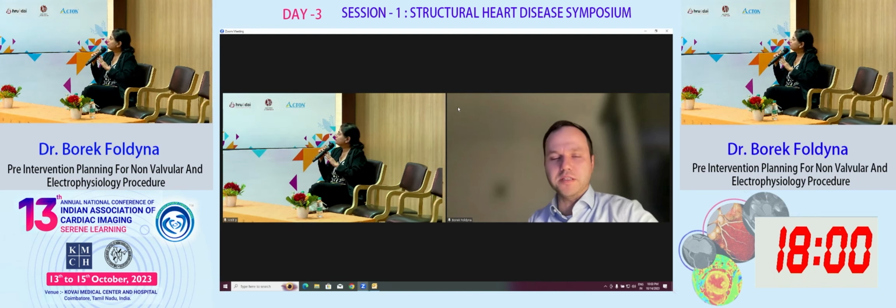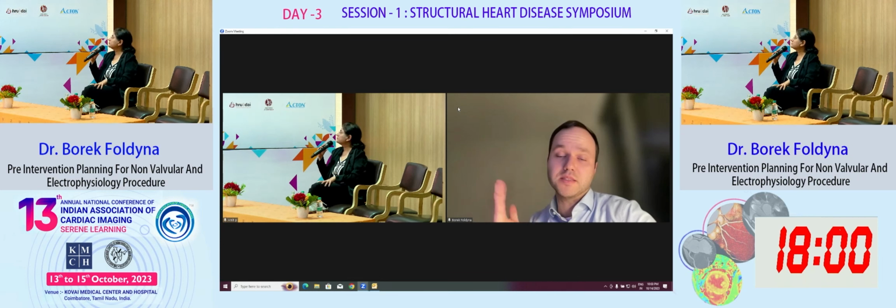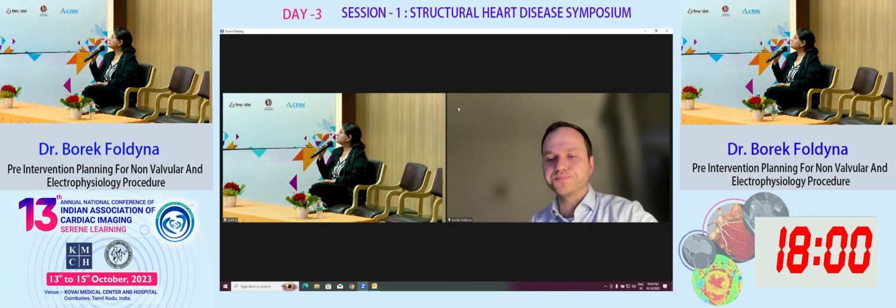So we are talking about the VTs in a left ventricle right now, right? Yeah, definitely, that's why we are looking at the layers. And I think with the new sequences, we use the sequence with 1.4 millimeters, so you can have 10 slices in a 10 to 12 millimeter myocardium. And the transmurality plays a role, of course.